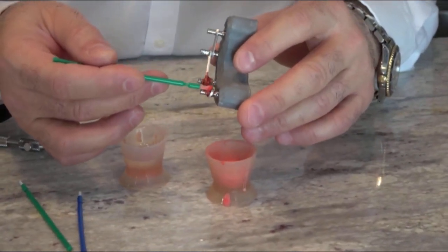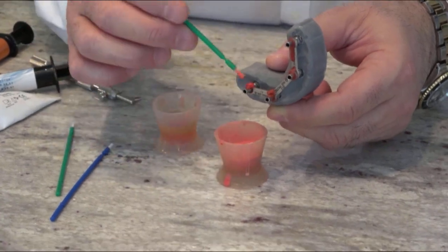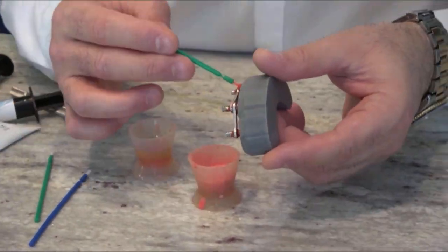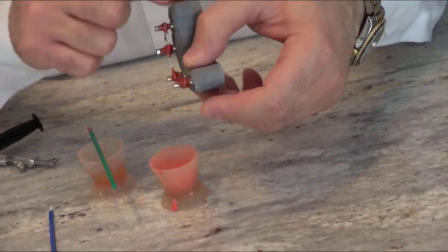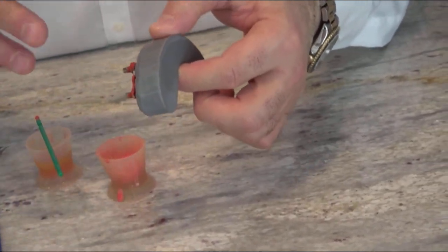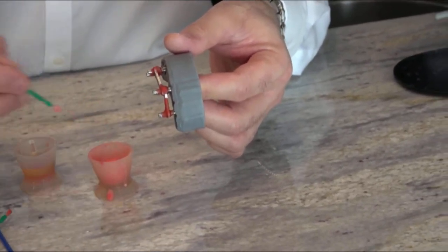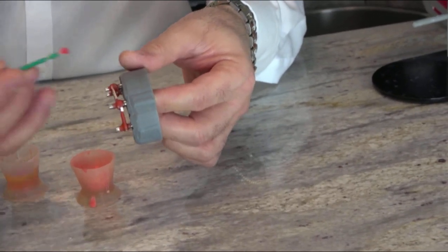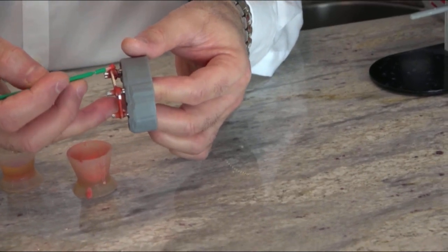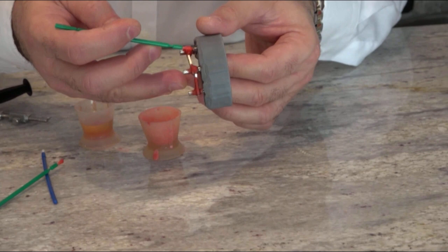If it touches the tissue in the mouth, it's no big deal - it's fine to keep it there. Keep adding a little bit more to strengthen the connection so it doesn't disconnect in the impression. I'm adding a significant amount to make sure everything is connected and nothing moves.